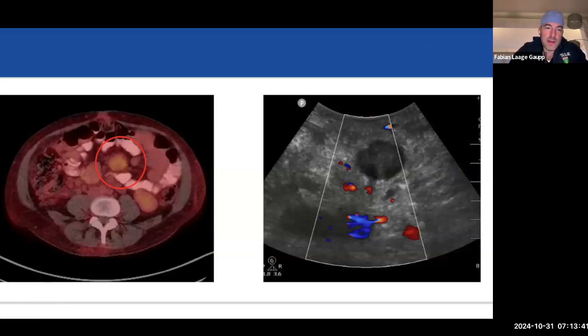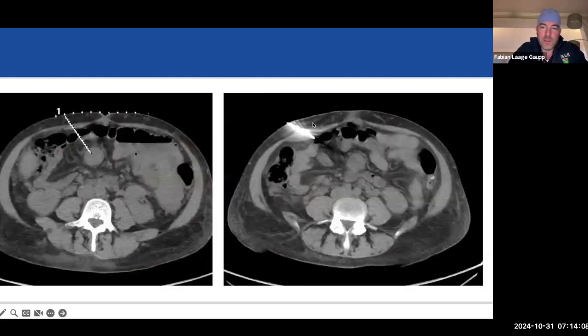Doug Sillin, one of my colleagues here at Yale, came up with it. It's just like a bowl that you would use to eat soup. You just cut a hole in the middle and strap that onto the patient's abdomen, then displace the organs with a belt, and do a CT-guided biopsy through that hole in the bowl. And what I did in this case was use the blunt needle.